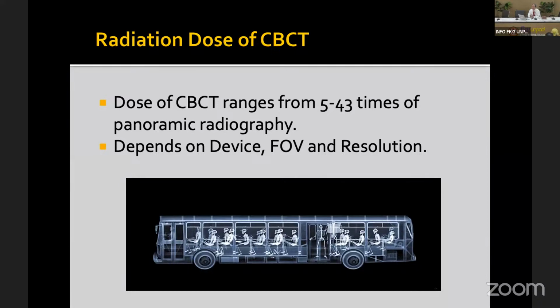Roughly, it's 5 to 43 times the panoramic radiograph. These days I would say maybe 5 to 10 times. But in the first generation, CBCT was about 40 to 43 times, which was a high exposure. Medical CT is about 100 times the panoramic imaging.